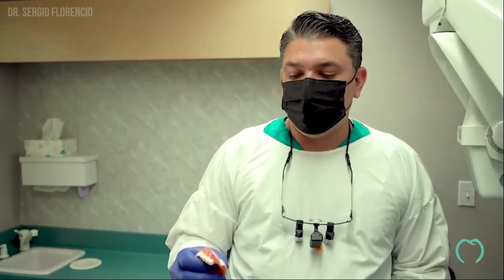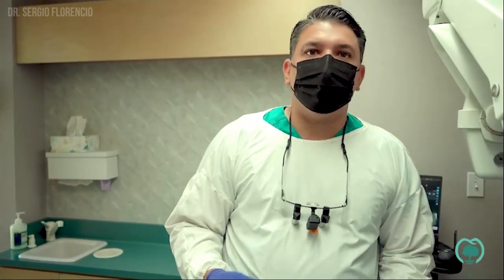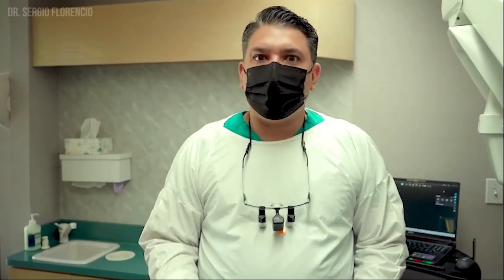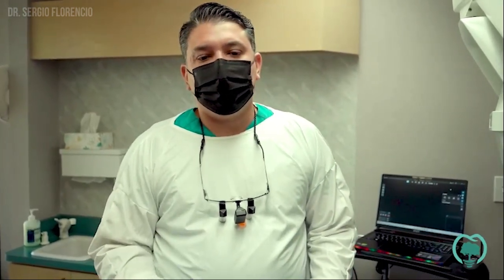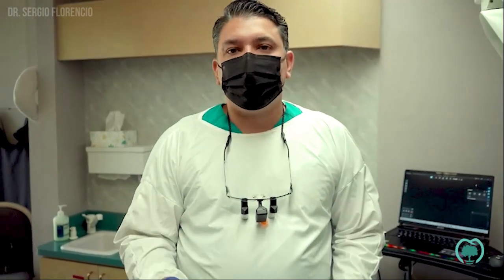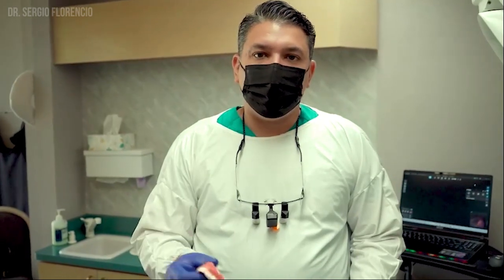We're starting a digital denture workflow. In this case, the patient has a trial denture — this could also be the patient's existing denture. If the patient has no teeth, you'd have an extra step: scan the tissues first and get a custom tray with wax or acrylic. If the patient has an existing or trial denture, you can do the denture delivery in two steps: initial records, then delivery or try-in on the second visit.